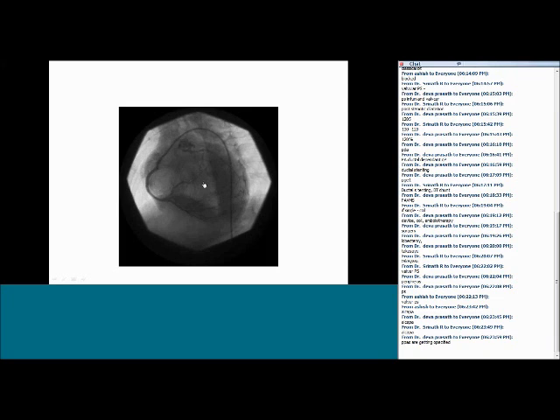At all the visits you should have a careful look at the coronary, because there have been reports where down the lane people have discovered anomalous left coronary artery. So that is very mandatory. Any case of dilated cardiomyopathy, please look into the coronaries, and also don't forget the arch for coarctation.